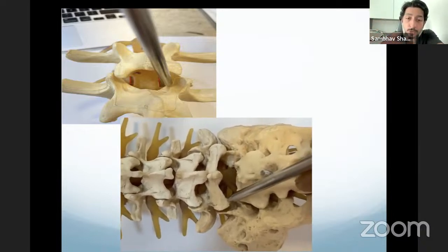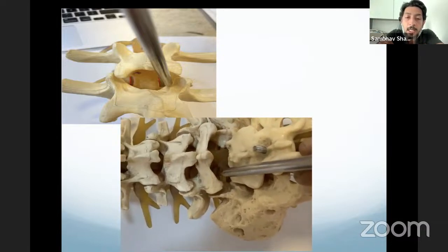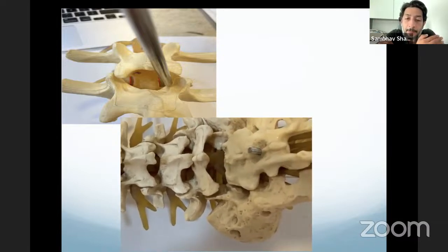side, the middle edge of the medial facet, and this is exactly where I dock my cannula, just at the junction of the lamina, facet, and the ligamentum flavum. The reason is that once you remove the soft tissue, when you see these three areas, you know exactly where you are. The problem initially with endoscopy is that you can get lost. Even though you're in a very small area, the soft tissue can be quite a lot.